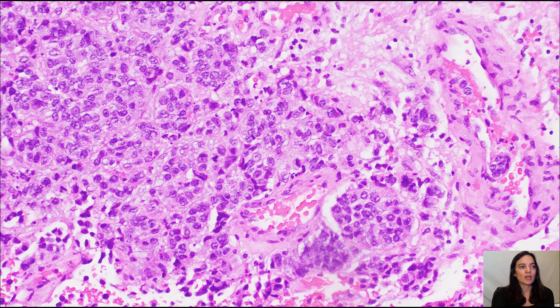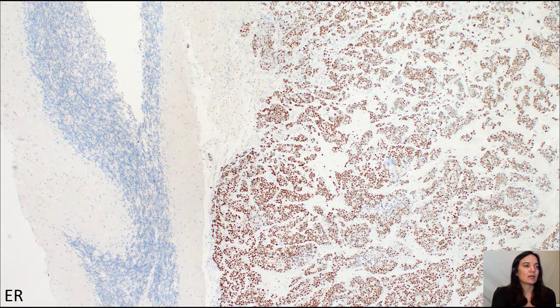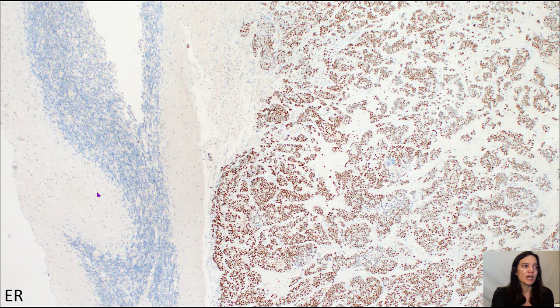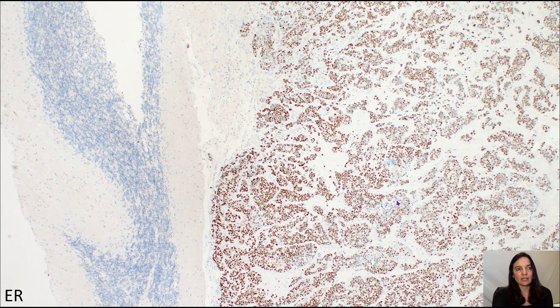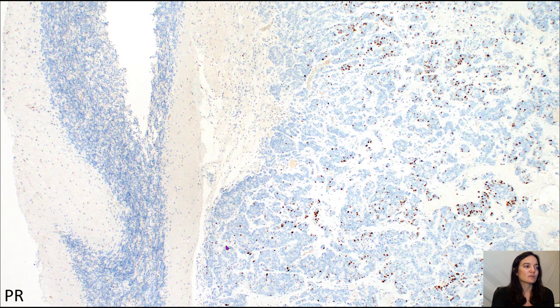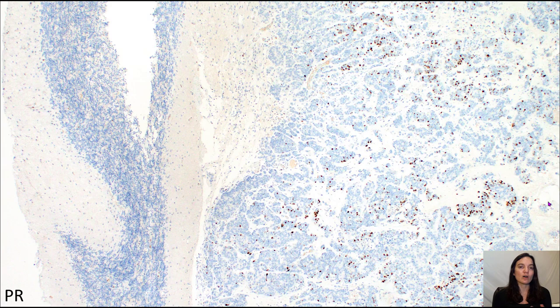In cases where it's hard to determine the tissue of origin, or when we want to prove it is breast cancer, we can do immunostains. Here on the right side is tumor and on the left side is non-neoplastic brain tissue — we can see the internal granule cell layer highlighted in negative relief — and that is normal cerebellum. On the right side we have immunohistochemistry for estrogen receptor, which is highlighting the tumor: this tumor is ER positive. In addition we have a PR stain, which is not as robust but is positive — so we have a breast cancer that is ER and PR positive. We would also do HER2, which comes out a little bit later.